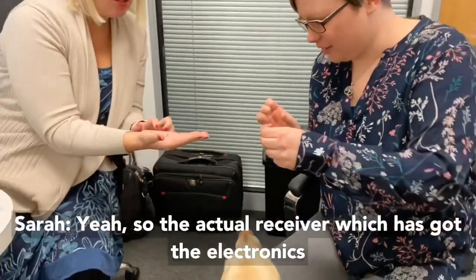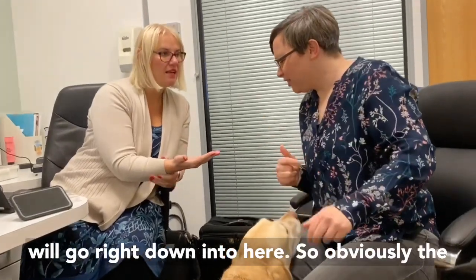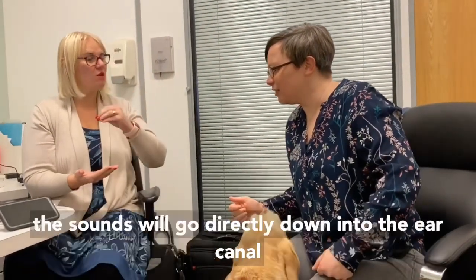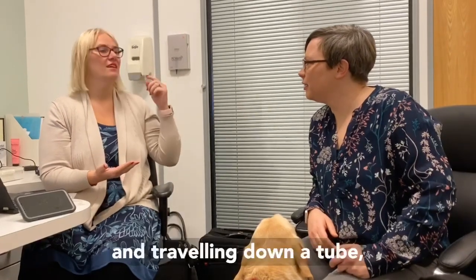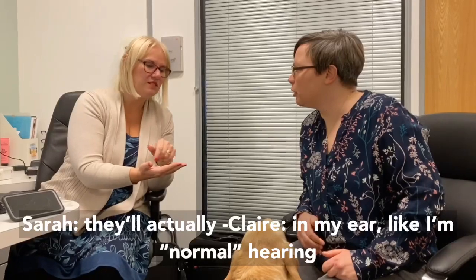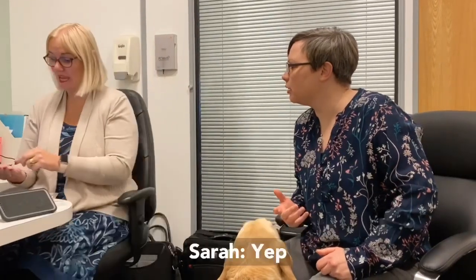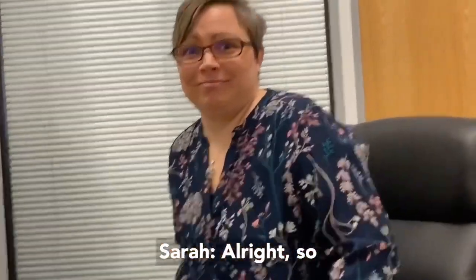Yeah. So the actual receiver, which has got the electronics, will go right down into here. So obviously the sound will go directly into your ear canal, rather than travelling down a tube. Yeah. It's going to be in my ear like normal hearing. Yeah. That is something else. Mind blown.